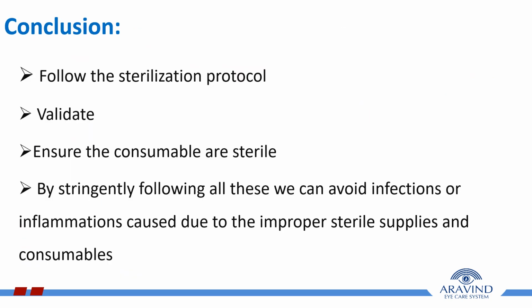So to conclude, follow the sterilization and validation protocol. Ensure that the consumables are sterile. By stringently following all these, we can avoid infections or inflammations due to improperly sterile supplies and consumables.